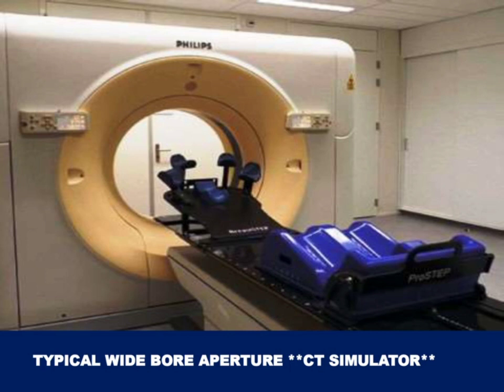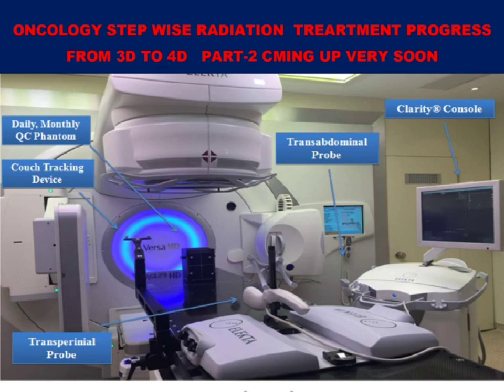So we use a typical isodose distribution on a 3D TPS for 3D conformal radiotherapy planning. You can see on the TPS the dose received by the critical organs, how much dose is received by nearby tissues, and whether the tumor is covered by the 90% dose. We can see all this with the 3D treatment planning system.